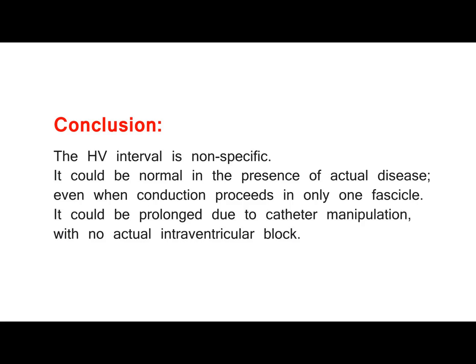It could be normal in the presence of actual disease, even when conduction proceeds in only one fascicle. It could be prolonged due to catheter manipulation, with no actual intraventricular block.